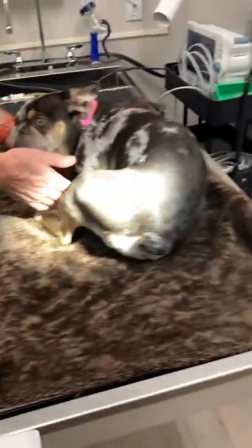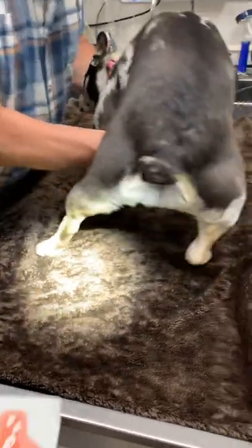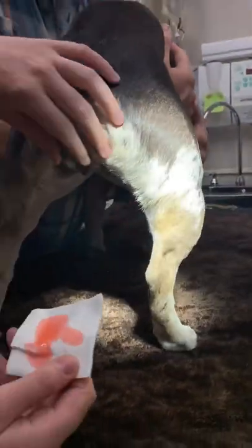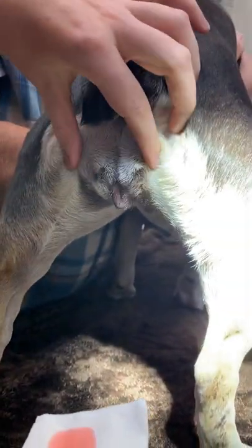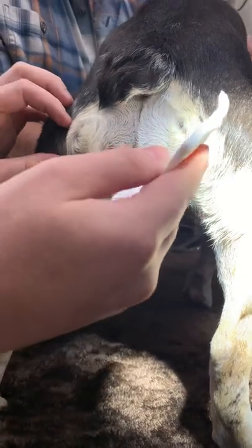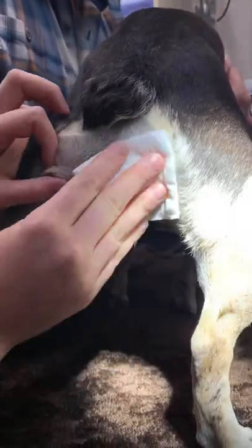I'm going to ask Dr. Jones, who is my clinical mentor and will be helping today with the video, to place Ro in a standing position. Now we're going to take a look at her vagina here. This is the area where we're going to be prepping. Her hair is fairly short, so we don't need to be shaving that down today. I'm going to do a gentle prepping here.